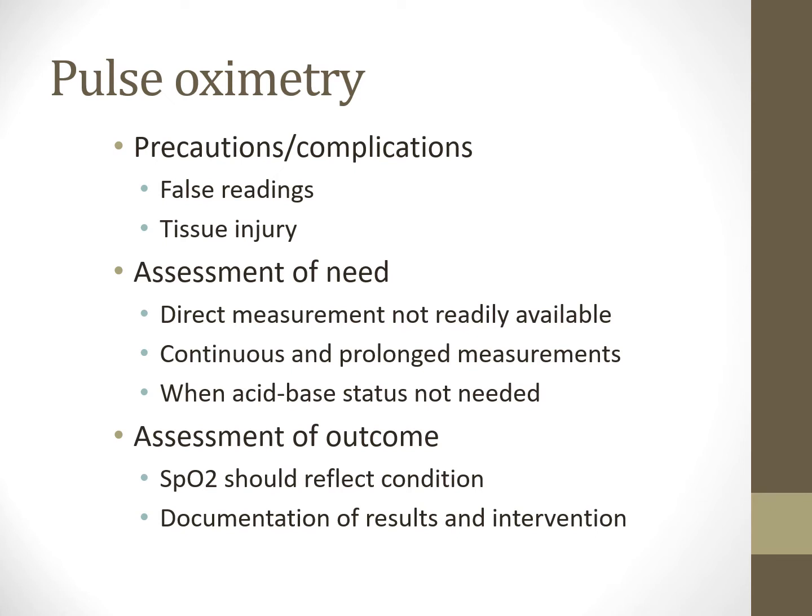Assessment of outcome, it should reflect their condition. So if you're looking at a pulse ox and it's hardly any waveform and it's reading 70% and the patient is pink, right? Their extremities are well perfused, they're talking to you, right? They're not working hard to breathe. Odds are it's probably a bad pulse ox probe or something like that going on, or signal, right?